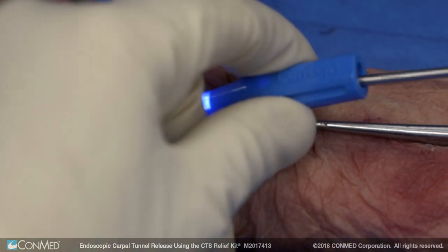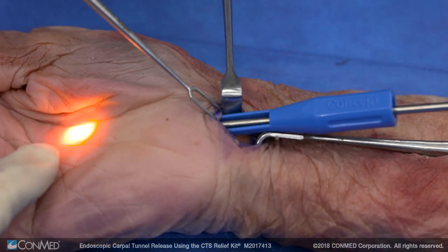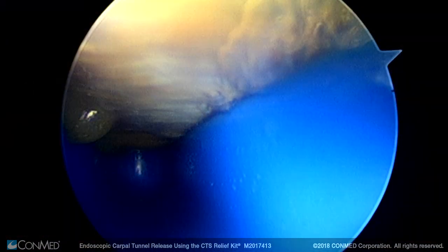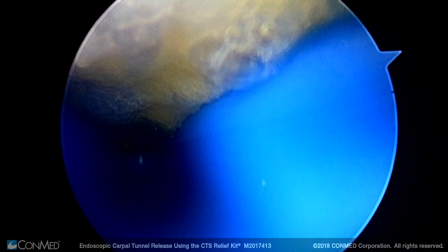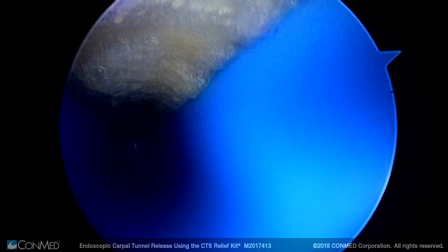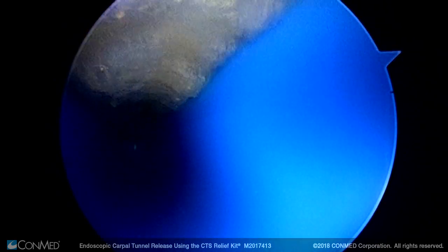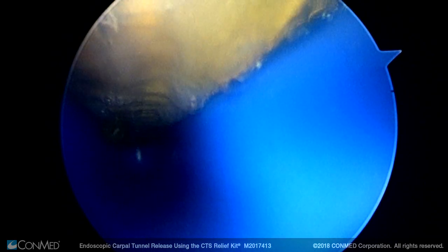The scope goes in and you will be able to visualize your ligament. You can see the light source there, so we can see the undersurface of our transverse carpal ligament through this slotted guide. We can see the origin here, the proximal aspect, and then all the way to the distal aspect of the transverse carpal ligament — and you can see that the median nerve is not in the way, so it's protected.